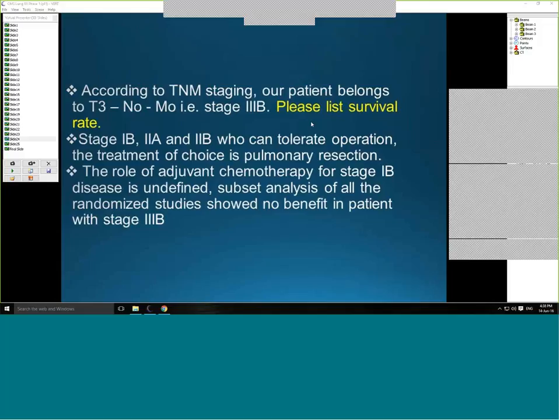And then as Jim mentioned in the presentation, what we actually did was able to take the DICOM plan and change that and alter it so that you can then bring it into your planning system, and then you can actually rework that plan. And that is really the important step and the link that goes between this presentation and using it as a Vert resource.